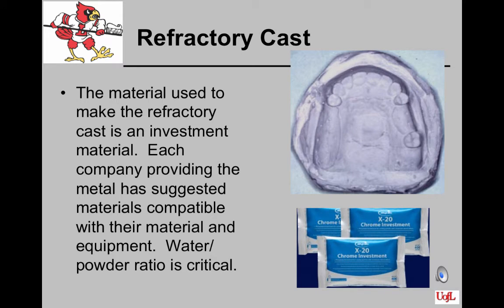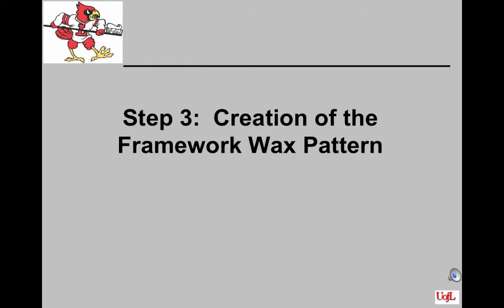The metals that we use require a high heat investment material to be poured into the mold. Each company providing the metal has suggested materials that are compatible with their metals and equipment. The water powder ratio is critical to the production of a good cast. The laboratory technician will trim the cast and then it will be ready to place a framework wax pattern on it.